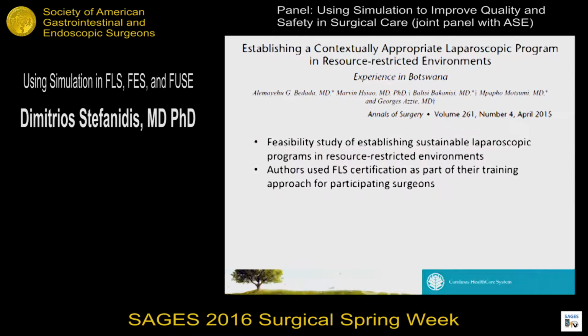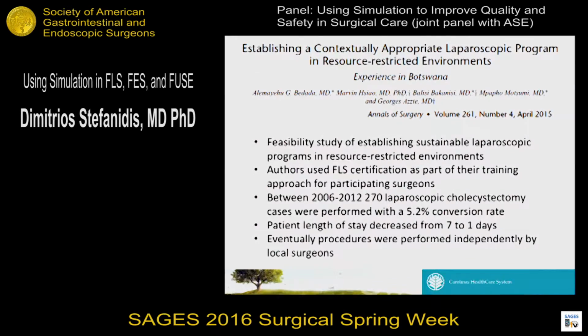The surgeons were not doing laparoscopy, and they used a training program that included FLS as part of gaining laparoscopic skills. They also had proctors that helped them for the initial cases, but they were able to become independent laparoscopic surgeons over a period of years. FLS was part of the whole process, but it definitely contributed to the training and the skill.